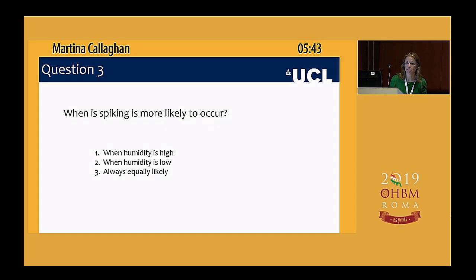So you mentioned that you can see motion in real time. Is that something installed in the scanner software? No, it's completely separate to that. Well, you need a little bit. Gadgetron is an open source framework, and for each vendor there is basically an interface that you can install. So that has to be installed on the scanner to be able to use Gadgetron. But there are other approaches that one could use. Basically, we use that so that we can get the data off. Once the data are off, they're sent to Gadgetron, which acts like a server, and then you can just take the data and do whatever analysis you want. Does that make sense? Is it still real time? Real time, yep, absolutely real time.